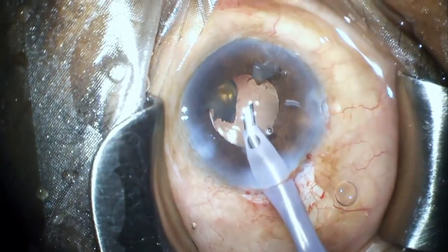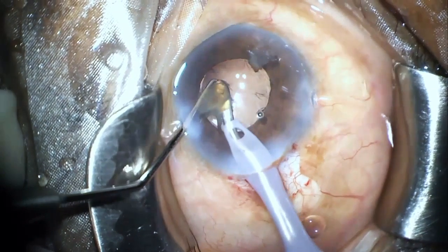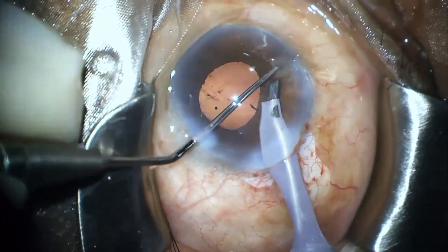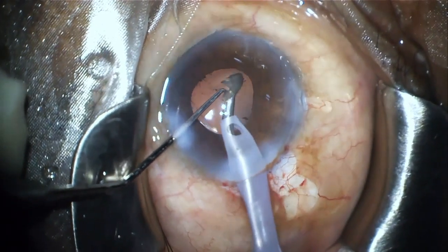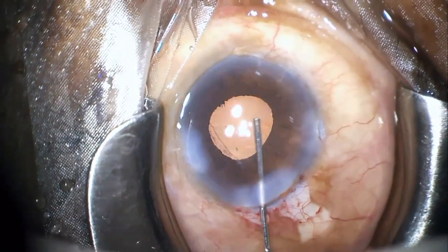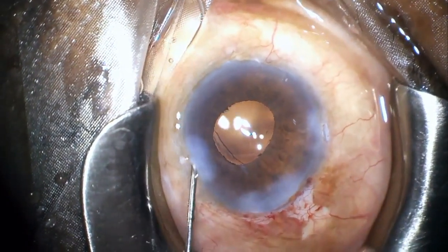Nothing really extraordinary in this case, but the reason I shared this is to show that if someone encounters a similar situation — a mid-dilating pupil with a suspected hidden fragment — implanting the IOL in the bag may help, as it did in the present case. Otherwise, of course, you have the option of using iris hooks and pupil expansion devices to tackle the situation in a better way. Thank you for your kind attention.